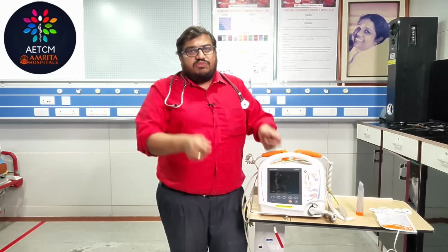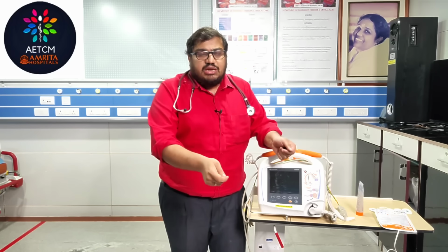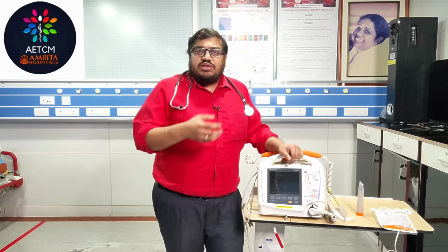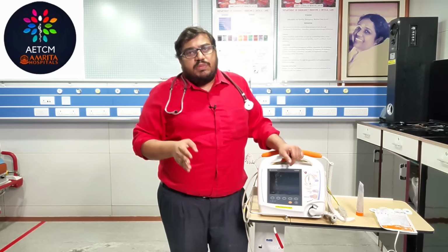Because in defibrillation, we just deliver the shock and come out. But in synchronized cardioversion, you need to keep it for another couple of seconds so that the shock will be delivered. The machine will identify the peak of the R wave and the shock will be delivered.